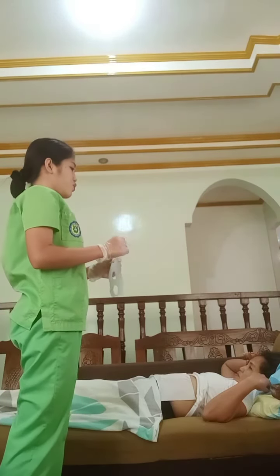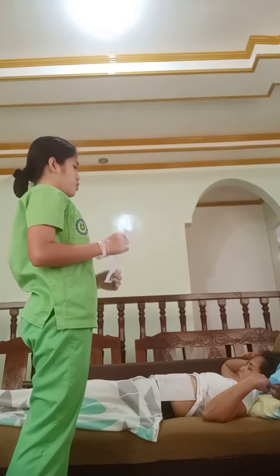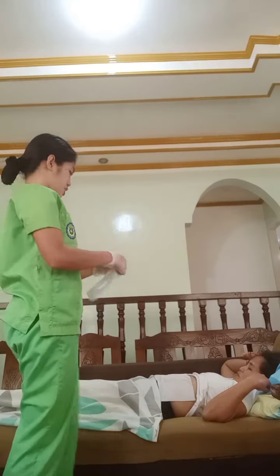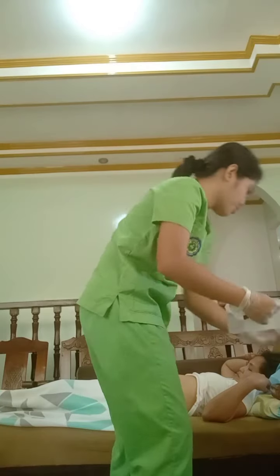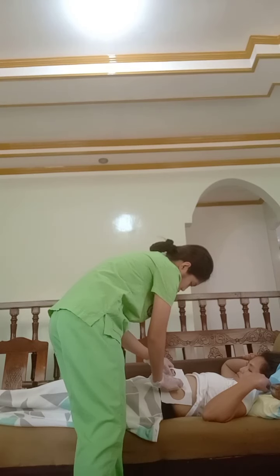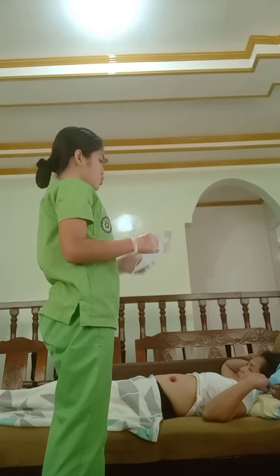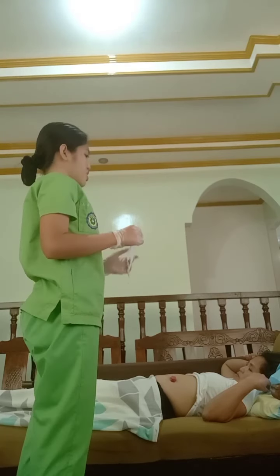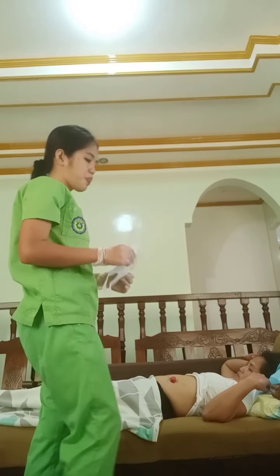So for the size here, trace it onto the colostomy pouch using a pen and cut it, making sure that there are no sharp edges to prevent skin irritation onto the stoma.